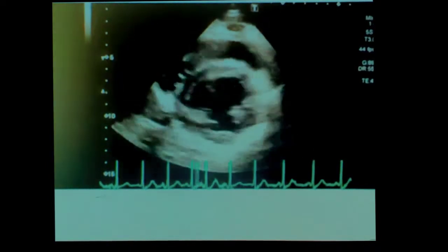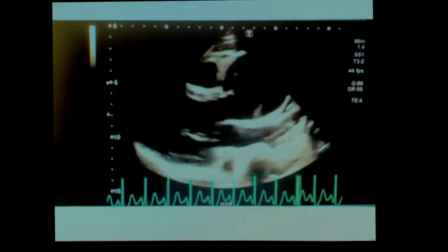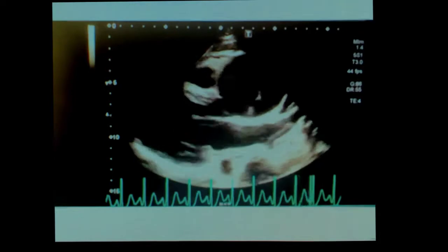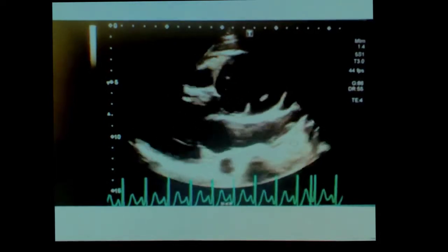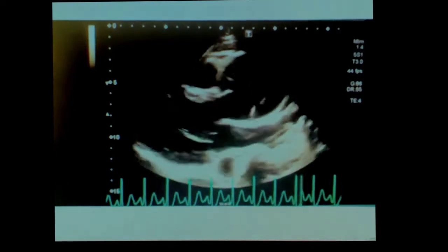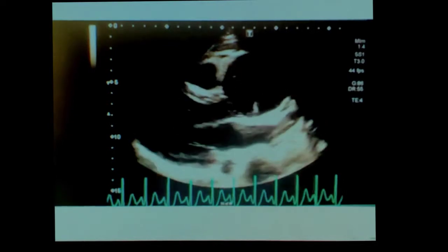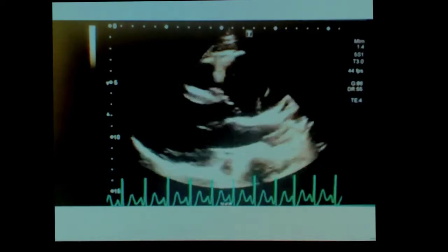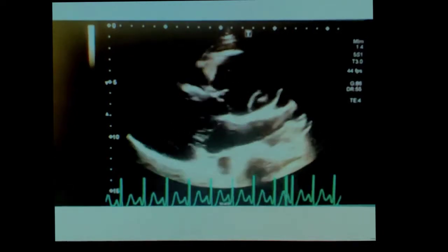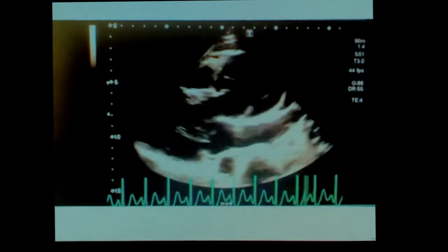Okay, Mo. Now, that's a parasternal long axis. It's definitely a PE. The most striking thing is the dilated aortic root. Right, dilated aortic root, severely dilated. Yeah, agree, 100%. That's a striking abnormality. What else is there? LV? You can see it. Actually, yes.